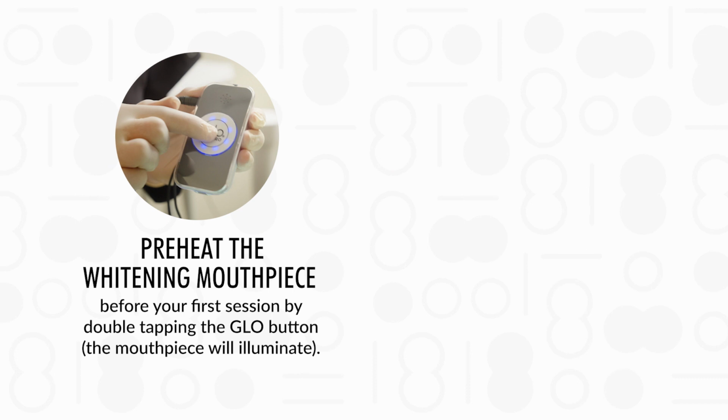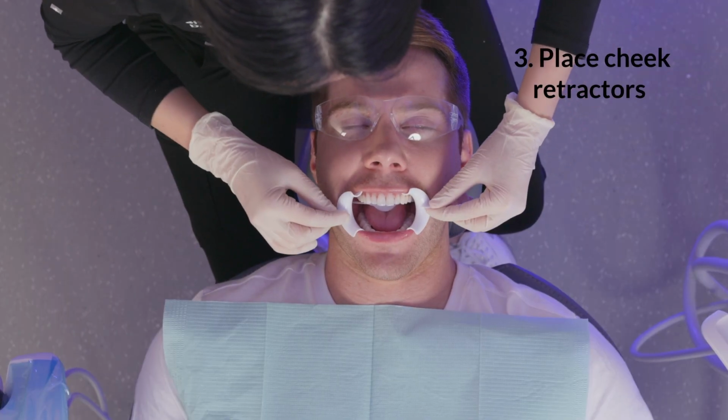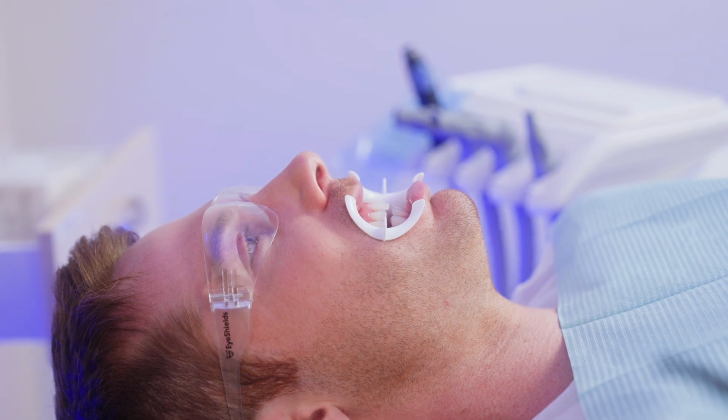Now is a good time to preheat the whitening mouthpiece before your first session by double-tapping the GLO button. The mouthpiece will illuminate. After your first 8-minute session, the mouthpiece will turn off and the yellow light will indicate the temperature is maintained while you prepare for your next session. Step 3. Carefully insert the cheek retractor so you can safely reach the teeth during treatment.